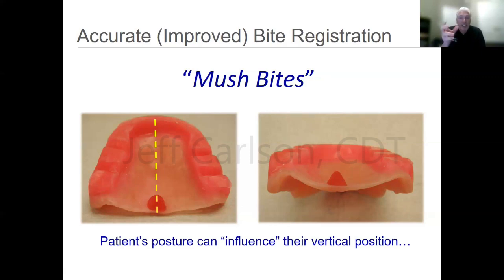You say, okay, Mrs. Jones, you see this little bump of wax I have back here, and it's important you put it to the posterior extension of this base plate or their denture. I want you to put the tip of your tongue on that and keep the tip of your tongue on that while I have you closed in, taking your bite registration. If your tongue comes off, no problem, let me know and we'll just start over again.